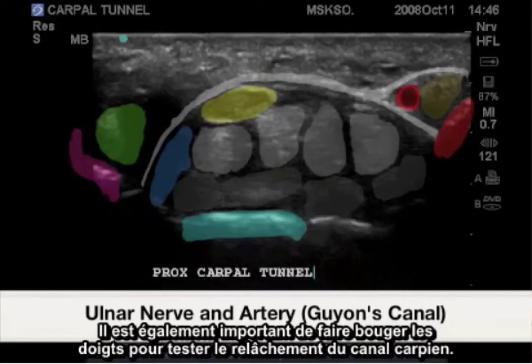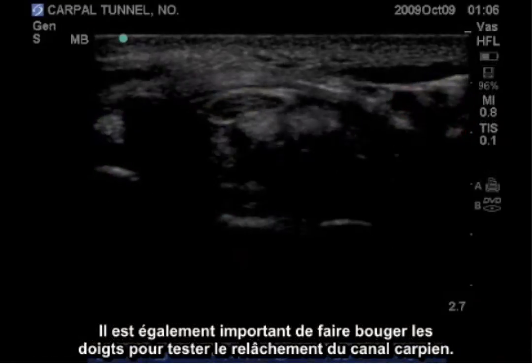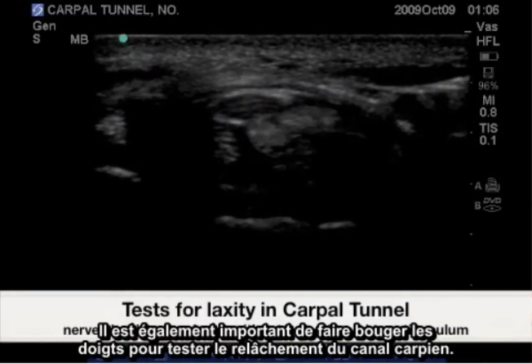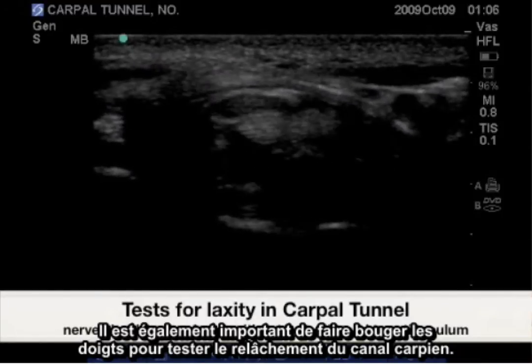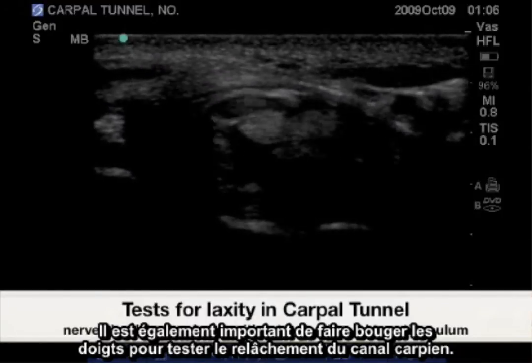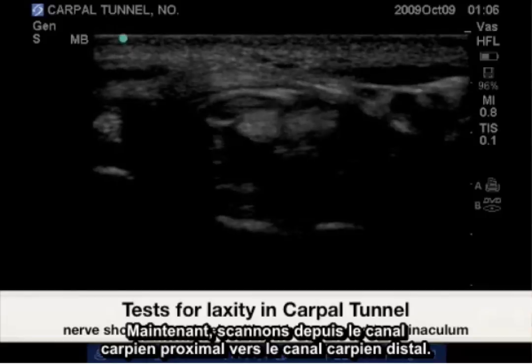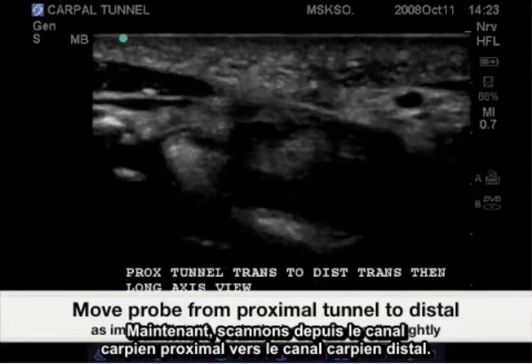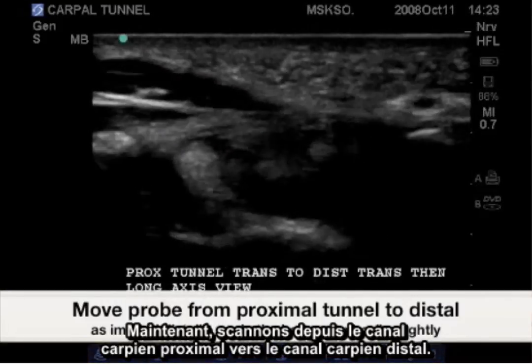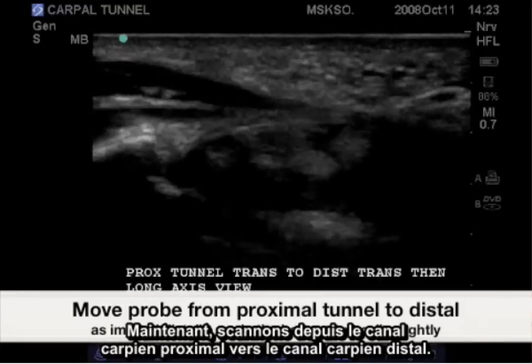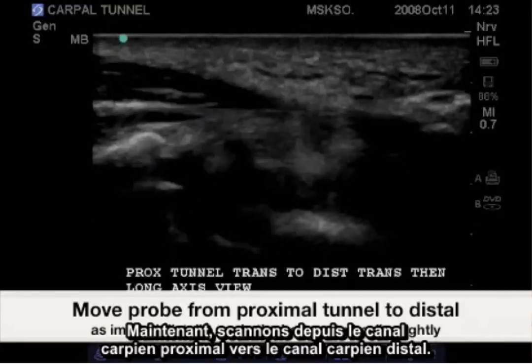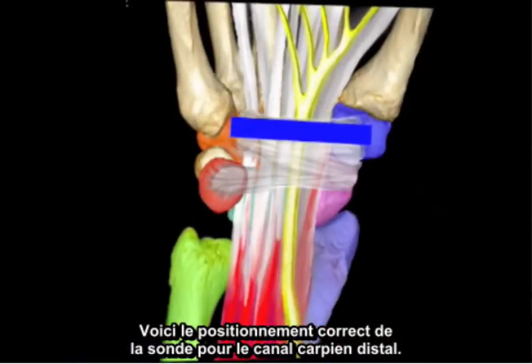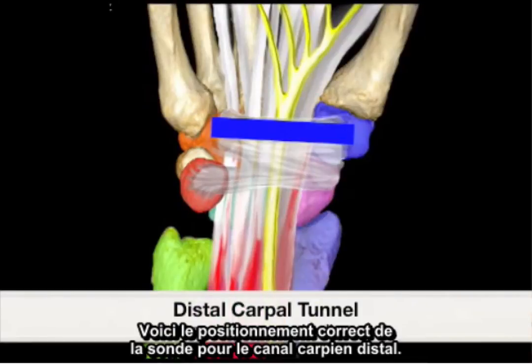It is also important to wiggle the fingers to test for laxity in the carpal tunnel. Now scanning from the proximal carpal tunnel to the distal carpal tunnel. Here is the correct probe placement for the distal carpal tunnel.